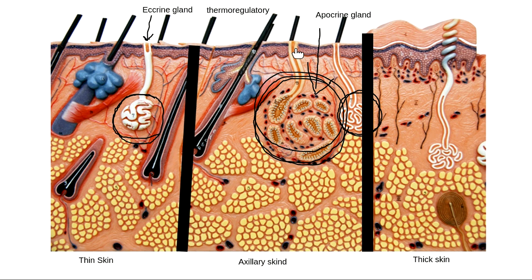And then there's one other major type of gland for you to be familiar with, and that's these ones right here. So let me circle it. And you can see it again over here attached to the hair. When we talk about the type of glands that are attached to hairs, those ones are called sebaceous glands. Sebaceous glands. The way to recognize a sebaceous gland is that it's attached to a hair. Sebaceous glands make something called sebum.